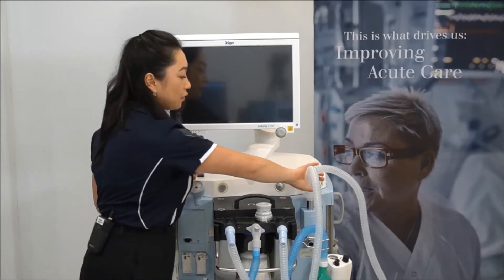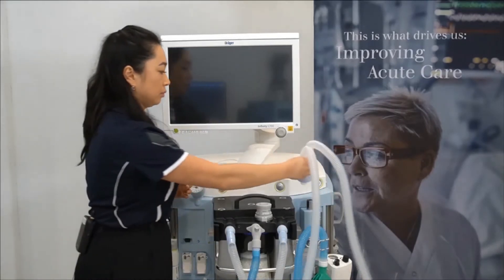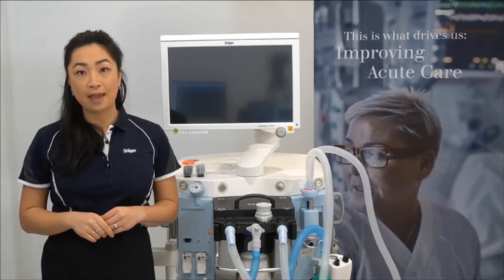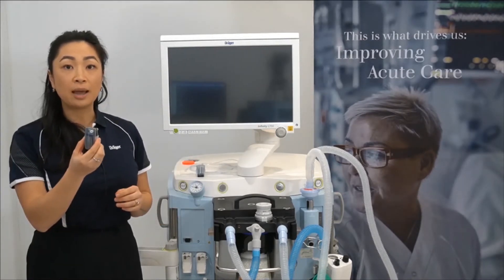Now to attach the filter — this is attached to the Y-end of the breathing circuit and should be changed for every patient.